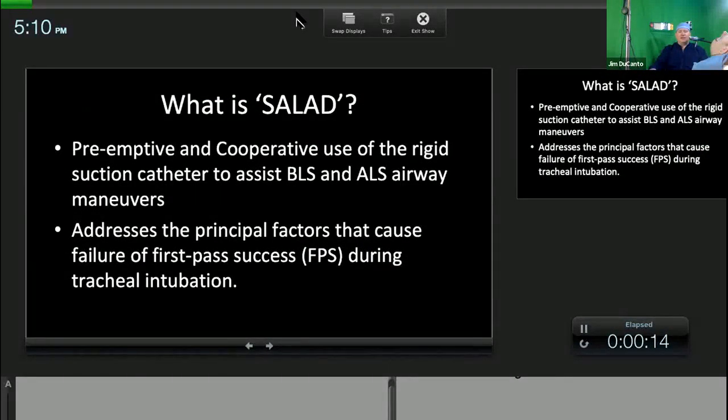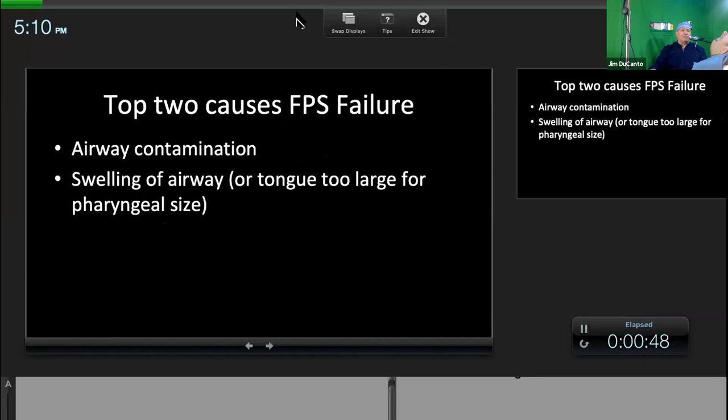So what is SALAD? It's when we're using the suction catheter preemptively. We're using it preemptively instead of simply waiting to see if we need to suction. We also physically use the suction as a tool to help you do the laryngoscopy or help you put in the supraglottic airway. This is addressing some factors that I believe cause failure of first pass success during tracheal intubation or supraglottic airway insertion.